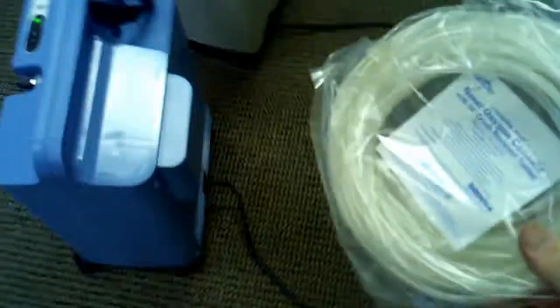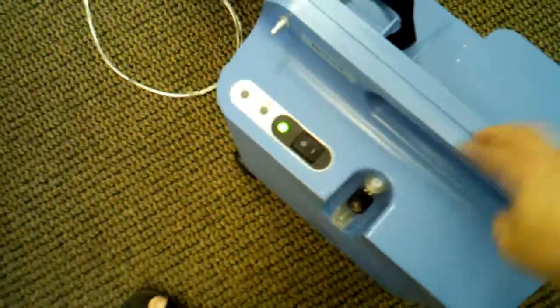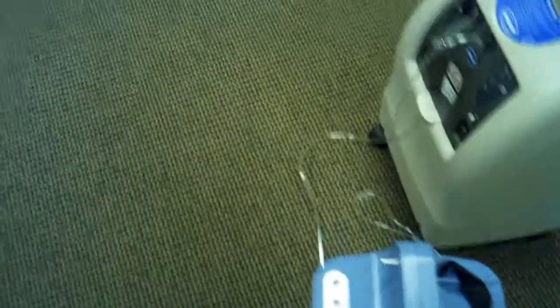Then we have the 50-foot, which is used for if you want to roll this around. As you can see, it's very easy to roll these. Some people like having their concentrator in one room, and they need to be on oxygen at night because their saturation level goes down. With this particular unit, you can actually roll it — it's very light — to the living room, and hook it up to the 50-foot so you can do what you need to do in the morning or afternoon around the house while being administered oxygen.